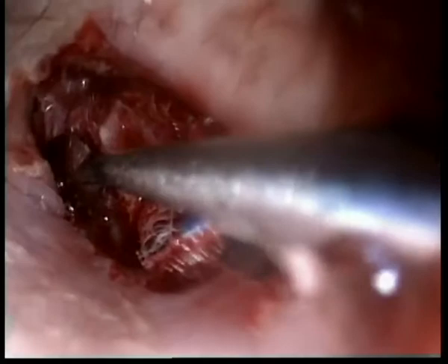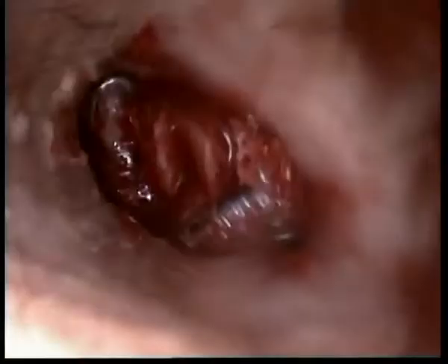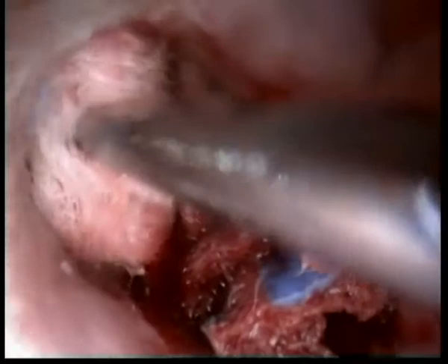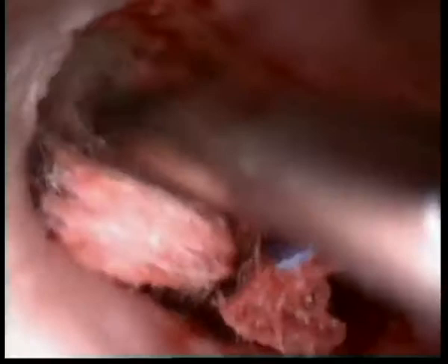When you're cutting, you push forward a bit this plate, because if you don't push forward, there's a bit of tearing of tissue, something that you've got to do. Give me a pledget again. As you could see, I leave a lot of pledgets, basically to tamponade bleeding. And see, it's elevated to bone, and I use the suction with the pledget as instrument. I think we elevated it superiorly, that's good.